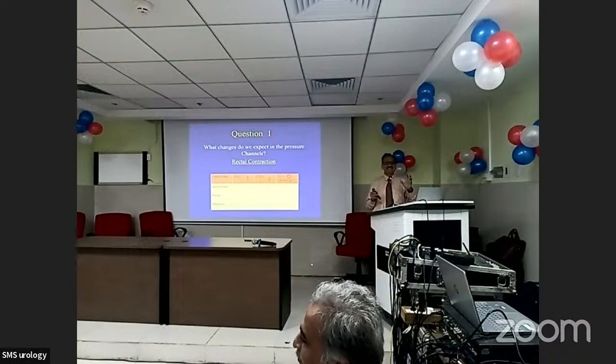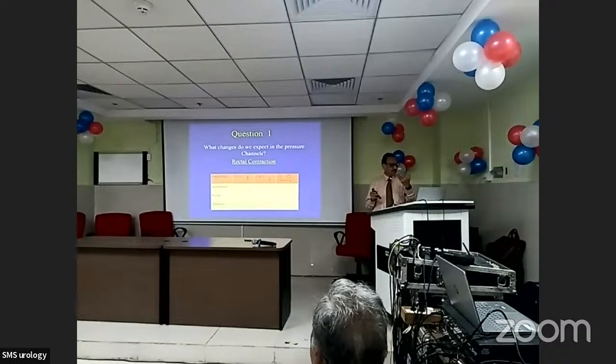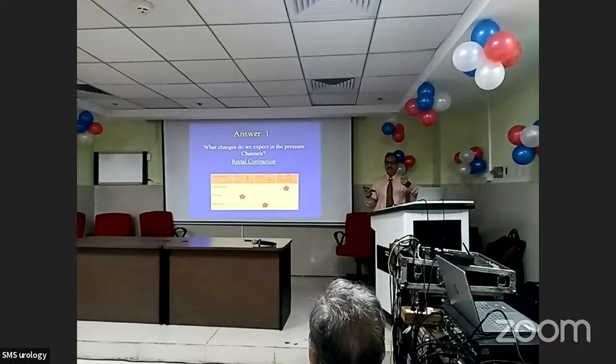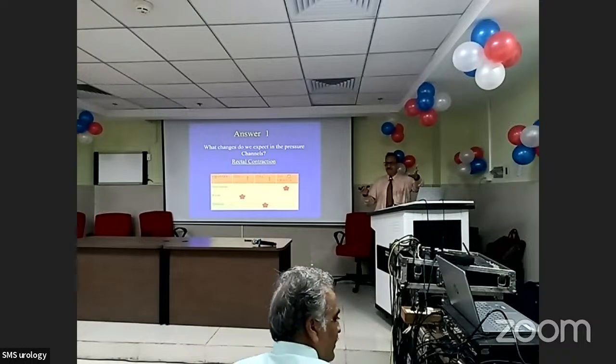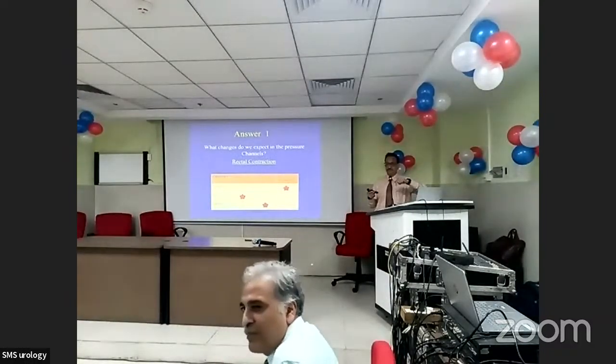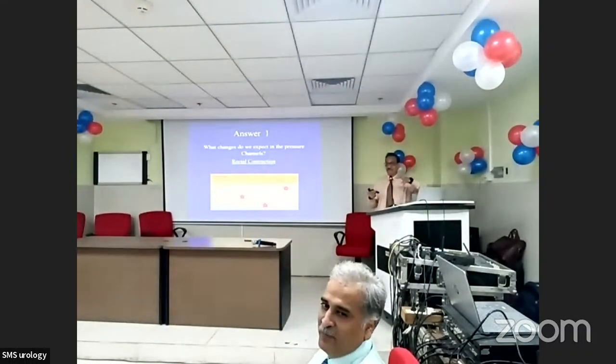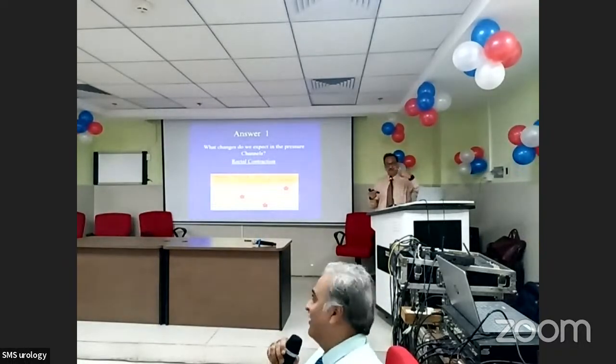So the audience feels the intravesical will rise, the rectal will rise, and there is no change in detrusor. Let's see what the answer says. Wow, something quite different. Intravesical, no change. The catheter in the bladder is not affected, because the detrusor is not contracting and abdominal pressure is not changed. And remember, rectal pressure measures abdominal pressure. A pure rectal contraction will not change abdominal pressure. Very important.